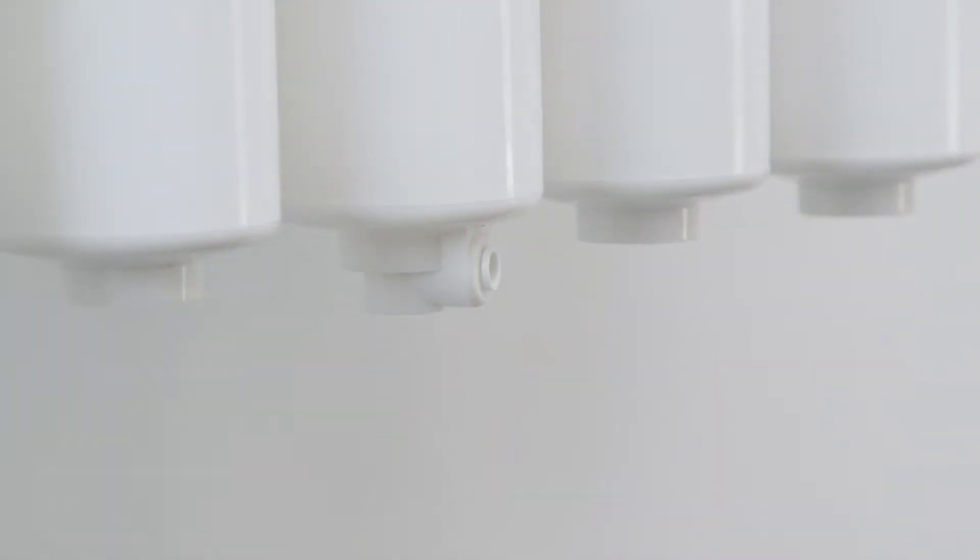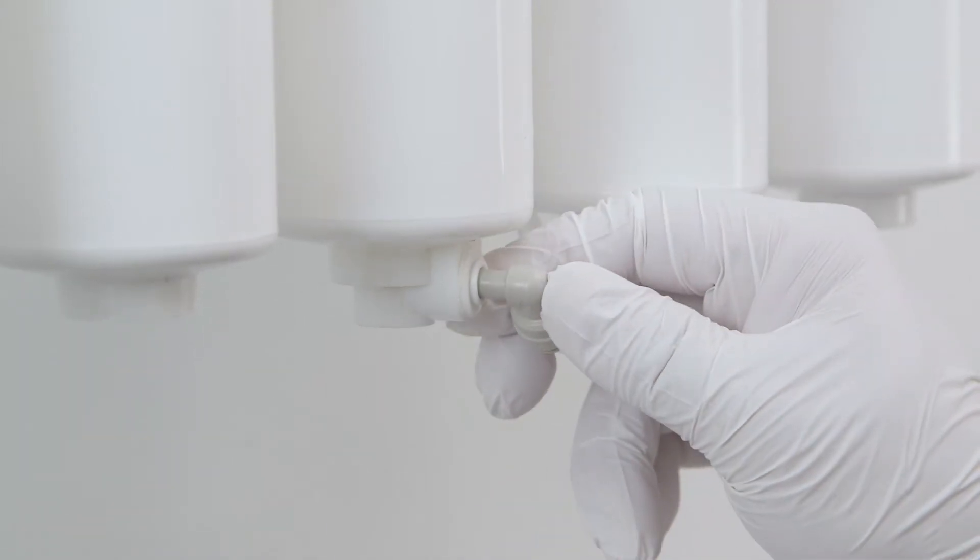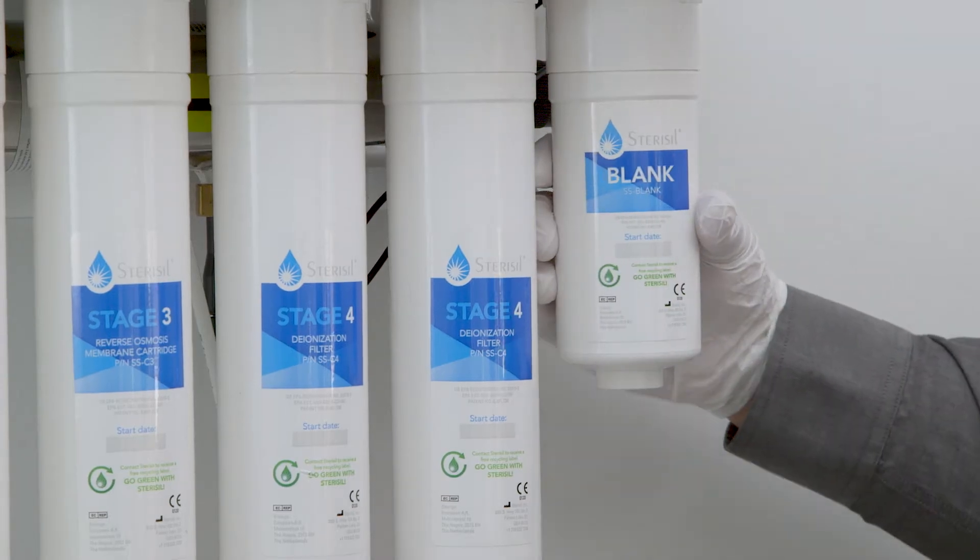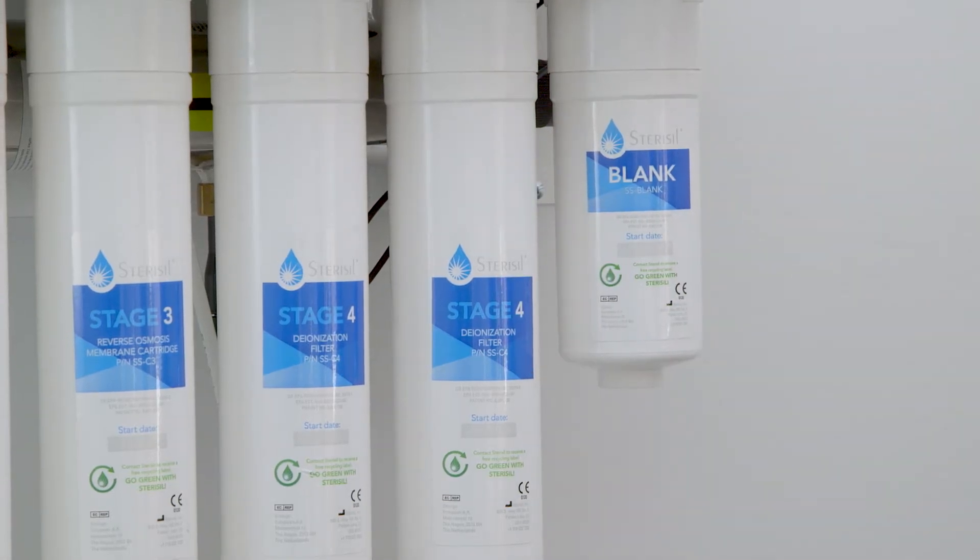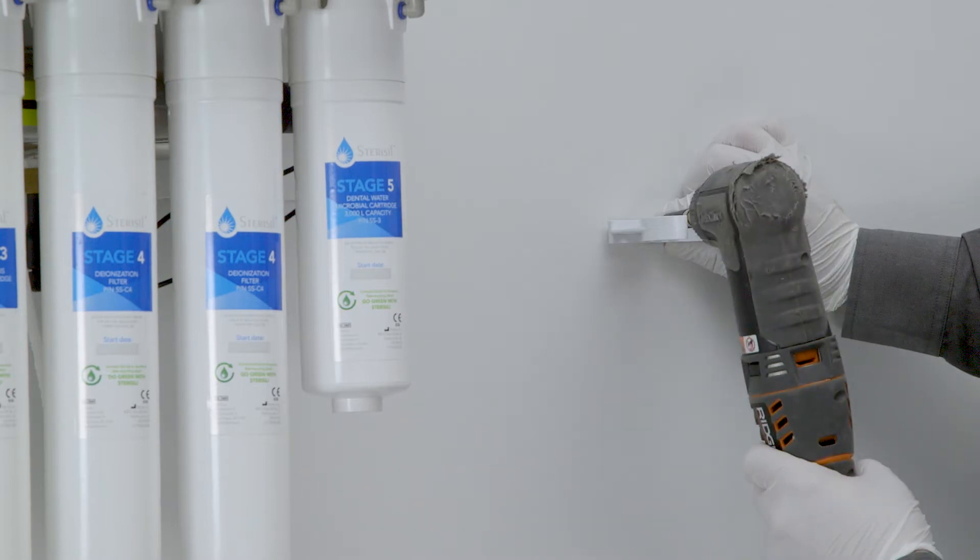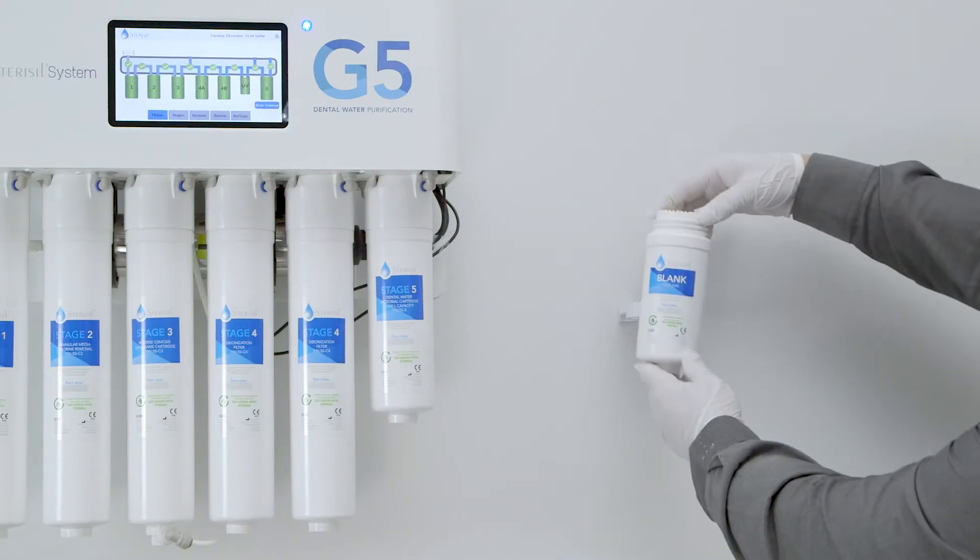Once all the cartridges are installed, remove the brine plug from the bottom of the stage three cartridge and insert the brine tube into the bottom of stage three. Blank cartridge. The blank cartridge is essential for troubleshooting possible blockages inside the system. Mount the clip on the wall near the system and place the cartridge in the clip.